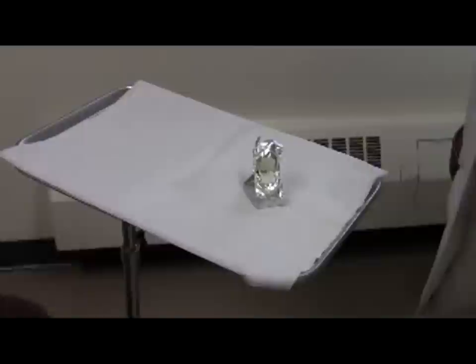Okay, so today we're going to do a scraping for a KOH, and so you see we have a 15 blade and a glass slide.